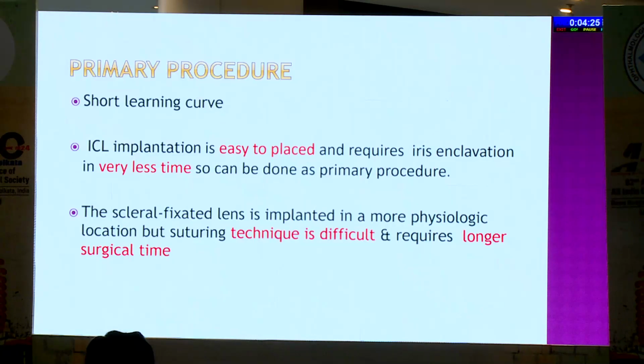It can be used as a primary procedure because it is very easy to place. Sir showed in the previous videos, it is very easy to place. It takes very little time, so it can be used as a primary procedure. The learning curve is very short. In contrast, with the scleral fixated lenses, the technique is difficult and requires suturing, so a longer surgical time is required.